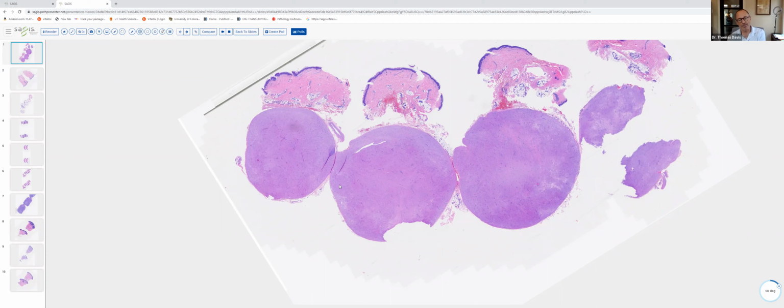The process clearly here is a neoplastic process, and within the subcutaneous tissue, one can see a very well circumscribed, very symmetric neoplasm. This has a very benign architectural silhouette. And as Dr. Vandergaard pointed out in last week's happy hour, when we're looking at a neoplastic process, you want to start at low power and assess the architectural configuration, looking for size, circumscription, symmetry, etc. You also can see zones of necrosis at low power, not in this slide, but anyway, those are the types of things you want to look for.